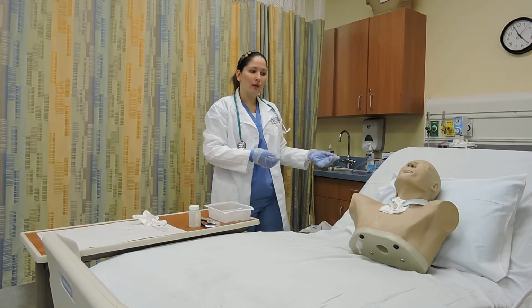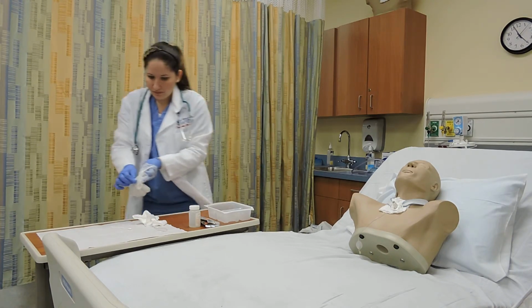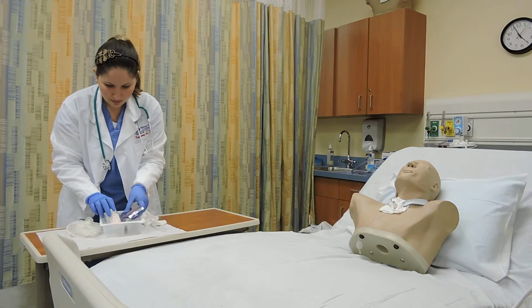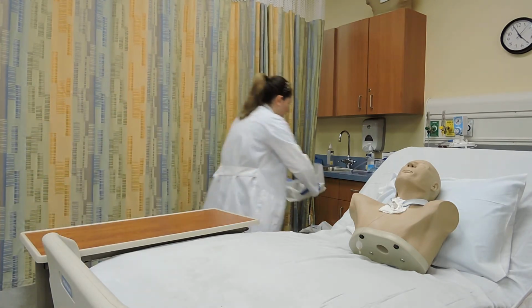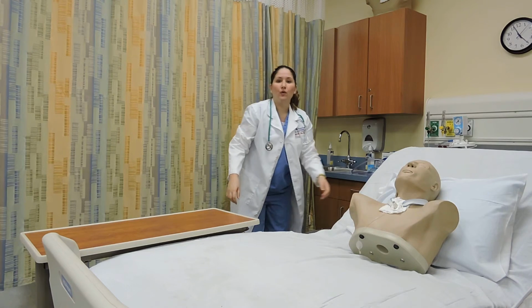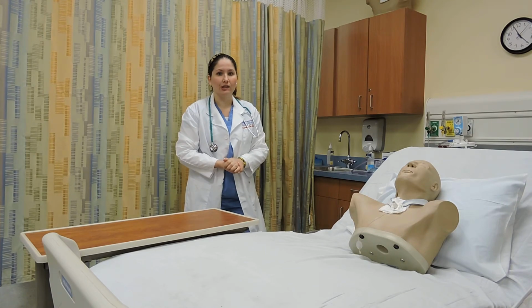If there's nothing else that we can do for him, I'm going to remove my sterile gloves, dispose of all contaminated materials, remove the non-sterile gloves, perform hand hygiene for at least 15 seconds, and document the procedure on the patient's chart.